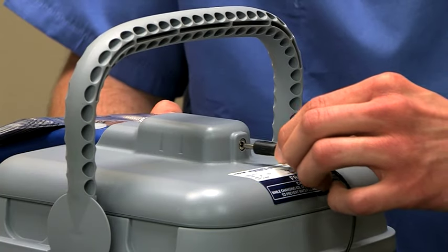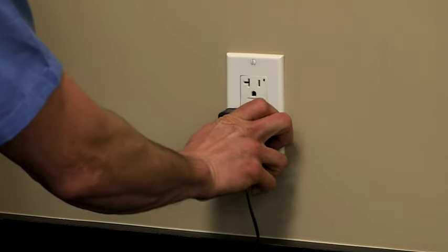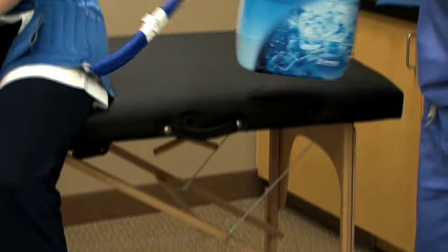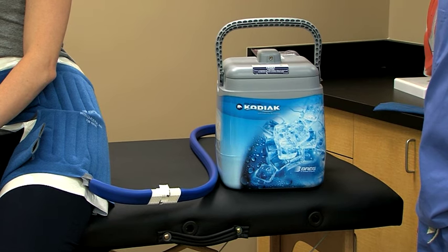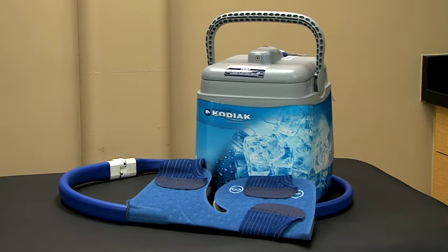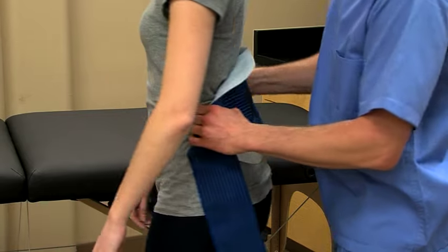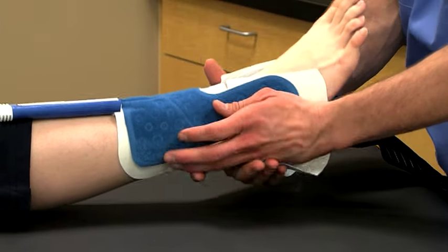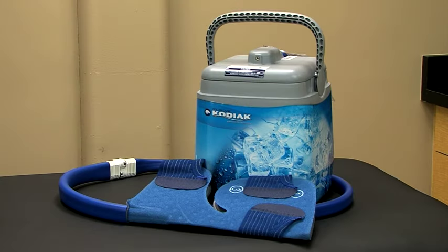Plug the power supply into the DC jack and plug the other end of the cord into a power outlet. Once it has power, the unit will immediately begin circulating water through the pad. The Kodiak is extremely quiet, so you may not hear the pump unless you get close. The average surface temperature of the insulation barrier over the pad will be between 45 to 55 degrees Fahrenheit for pads intended for use on core body parts, and 50 to 60 degrees Fahrenheit for pads intended for use on extremities.